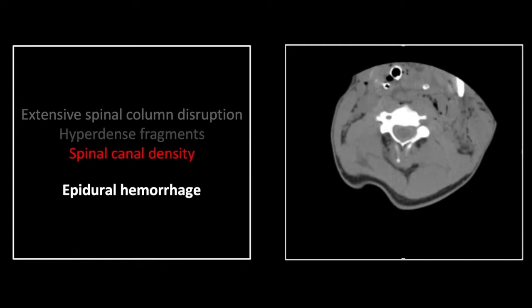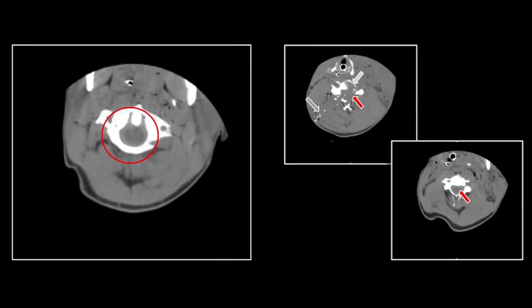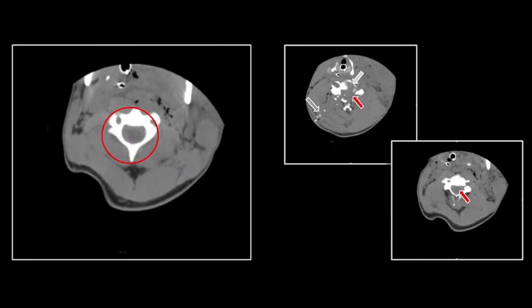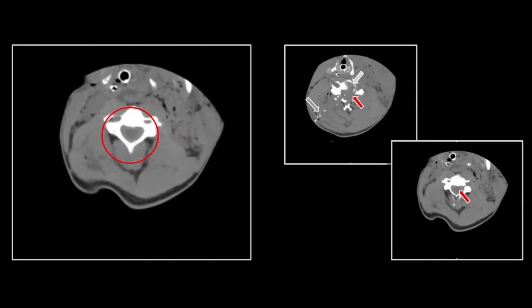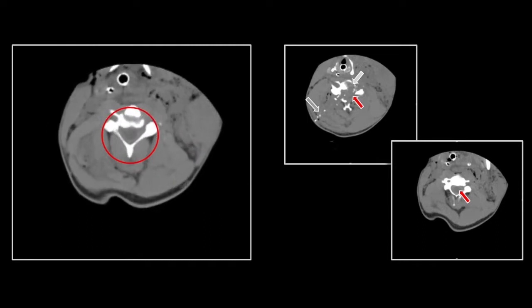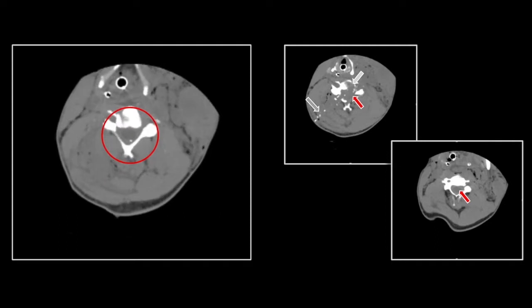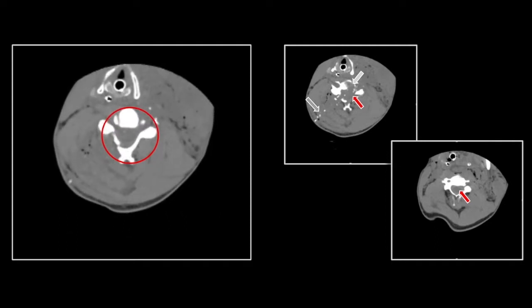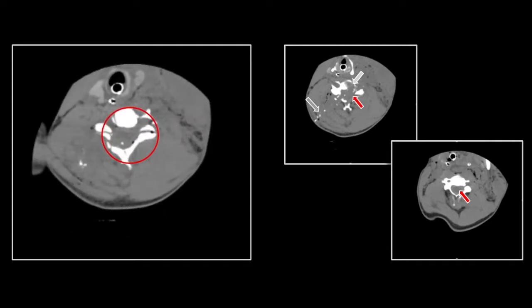Both above and below, it's important to appreciate spinal canal density consistent with epidural hemorrhage, extending well above and well below the level of trauma. Note the extent above and below the level of the injury itself.